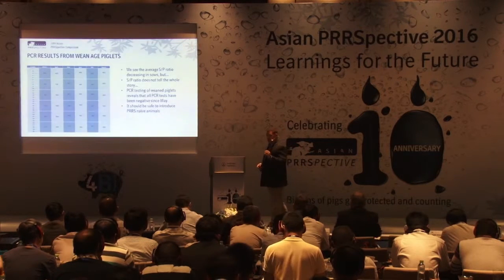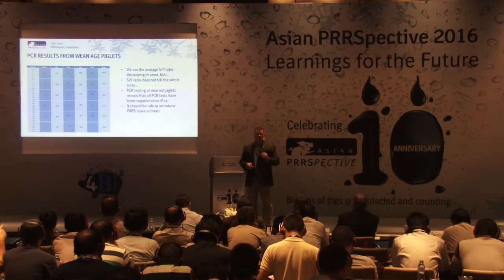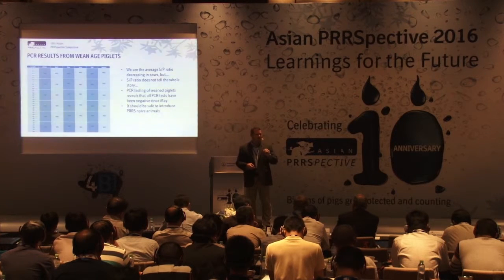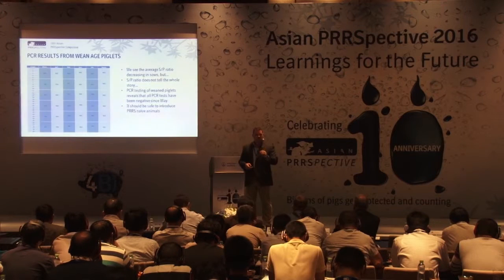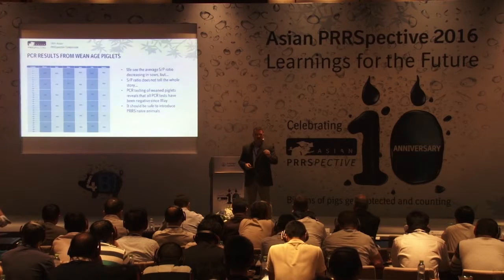Now, a couple notes on testing weaned pigs. When I test for PRRS in weaned pigs, I don't test the 30 healthiest pigs in the farrowing room. I go into the farrowing room and I find the 30 sickest looking, worst looking pigs I can find. Because I'm very confident if I take samples from the 30 least healthy pigs in that room, if I fail to detect the PRRS virus in those pigs, I can be very confident that the PRRS virus is not circulating in any of the other healthier pigs in that room.